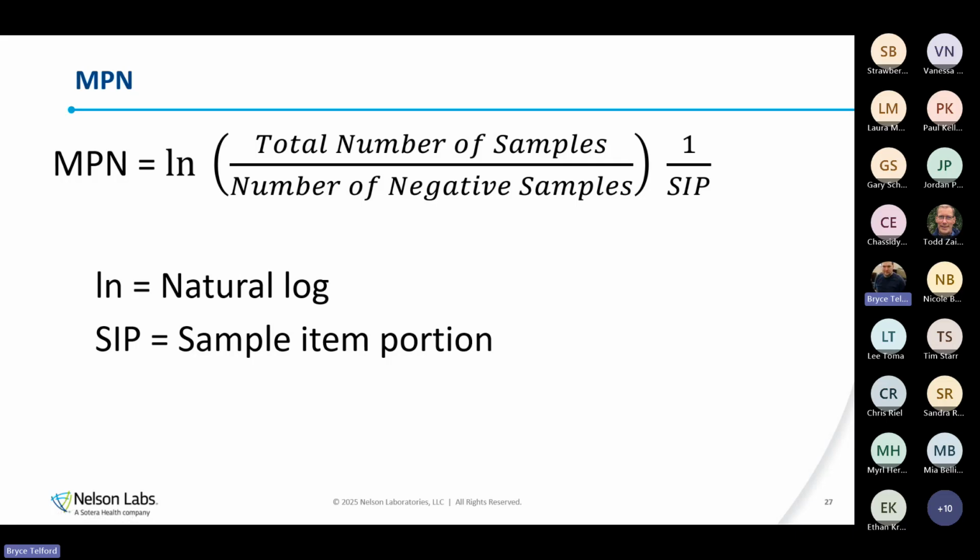When we're talking a little bit later about some of our very low doses, and if you're familiar with radiation sterilization, something such as VD-Max 15, which has a maximum allowable bioburden of 1.5 CFU, this is kind of the way that we get to those very low bioburdens: we can do most probable number testing in order to get us those very low doses.